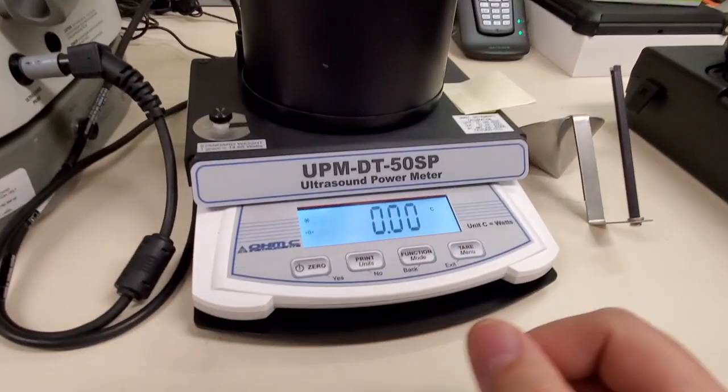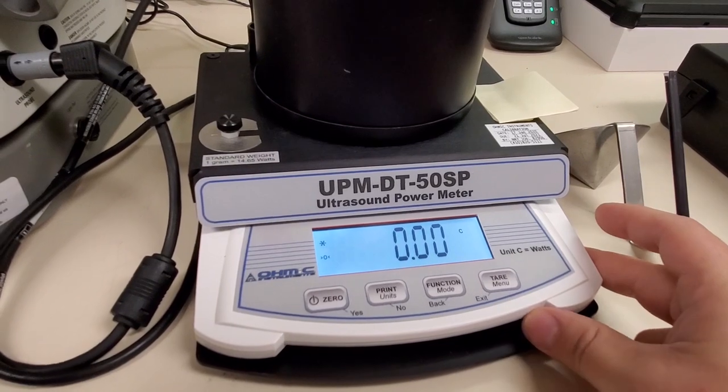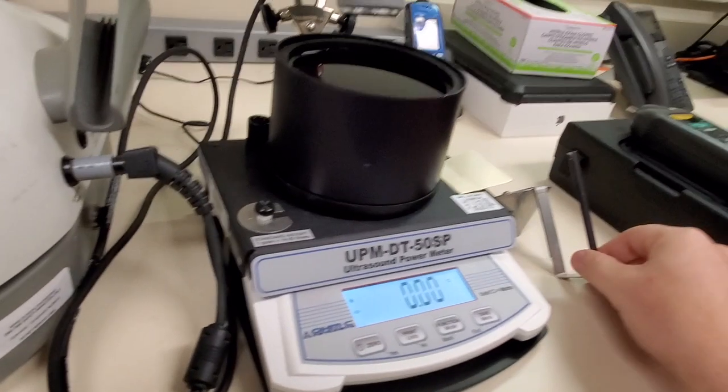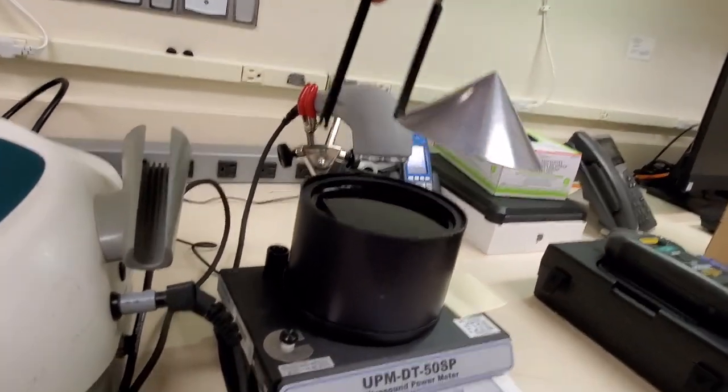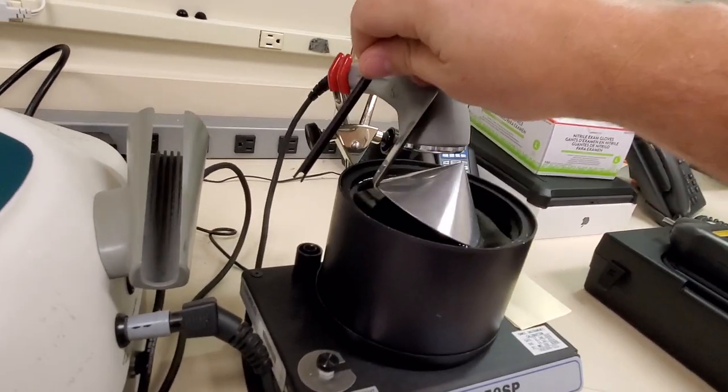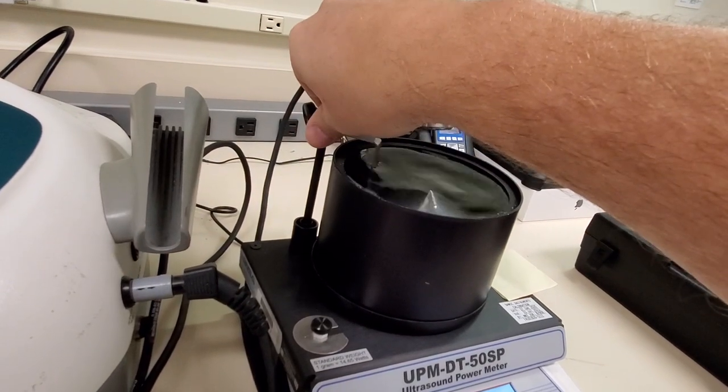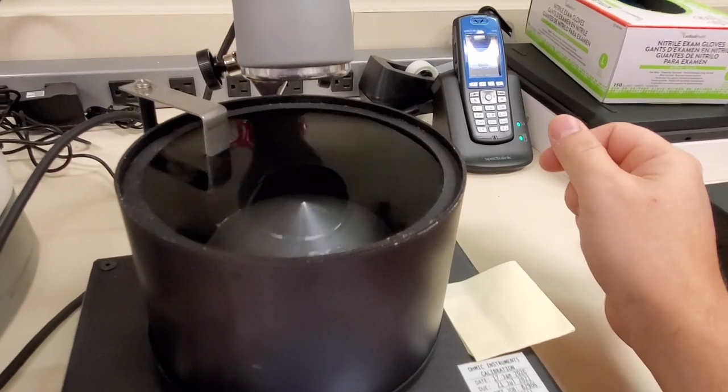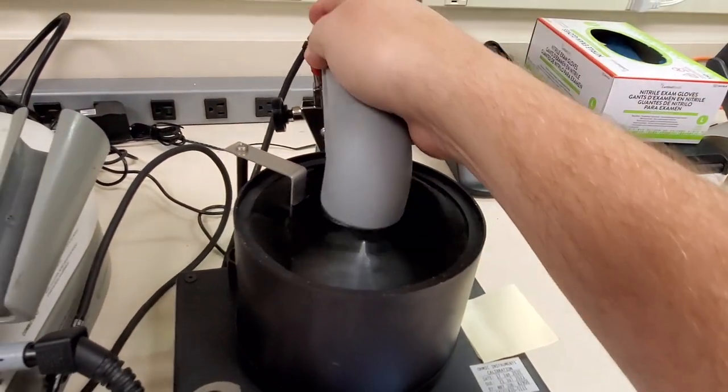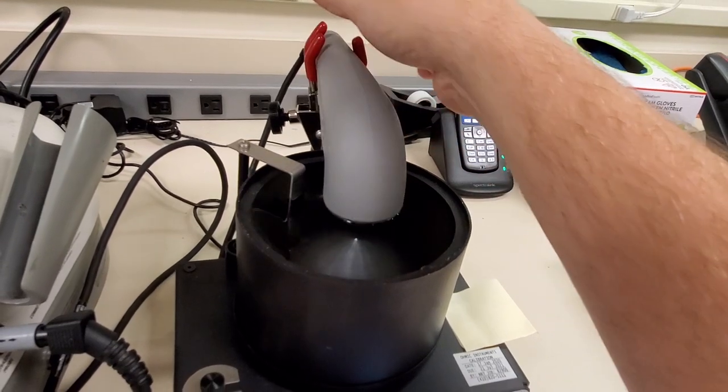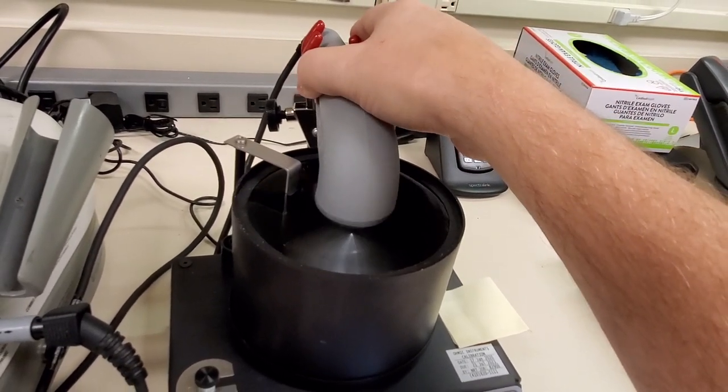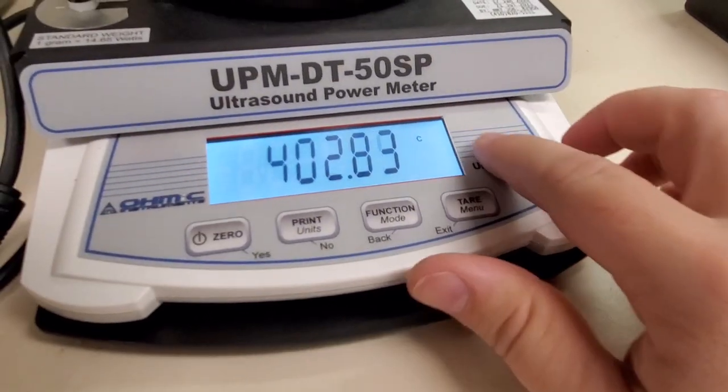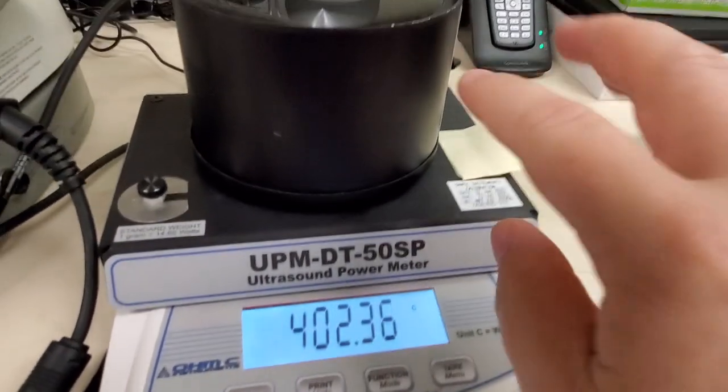We measure it using an ultrasound power watt meter, which you can see is just a modified OHAUS scale. It consists of a cone that's suspended from the measuring element. It goes into a bath of degassed water, and the head will lower down into the water right atop the cone. We let the water quit moving around.